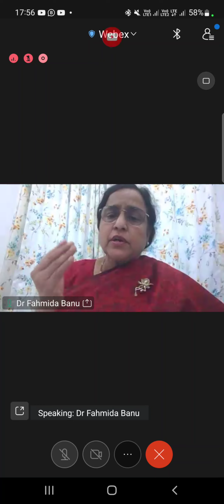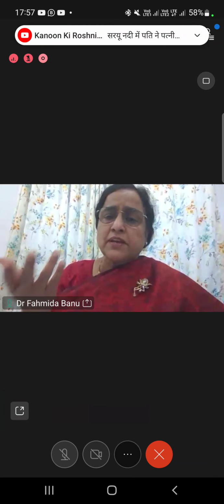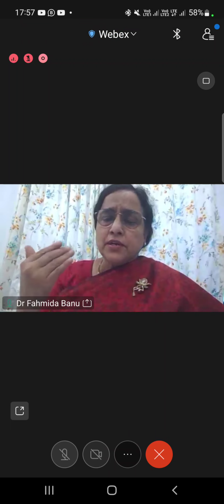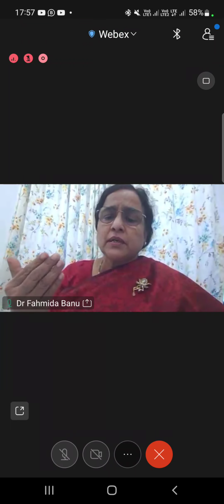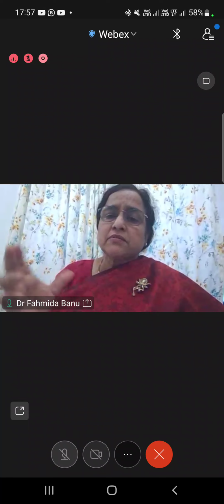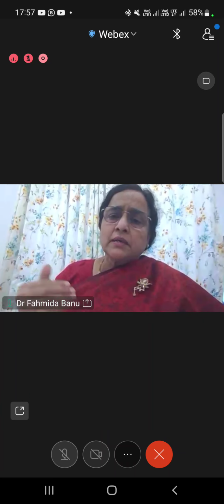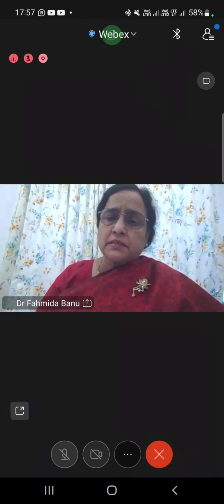It is safe. You just have to give 20 milligrams of IV Lasix. So there is a lot of difference. If you are able to use that much fluid, you will complete the procedure with that much fluid. Usually we use 3 liter bottles, and we keep an input and output observation.